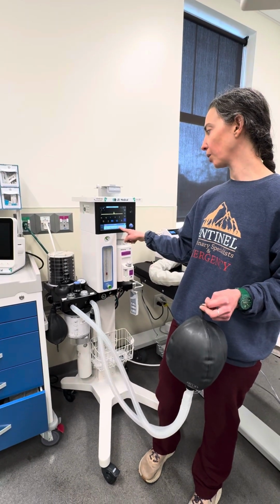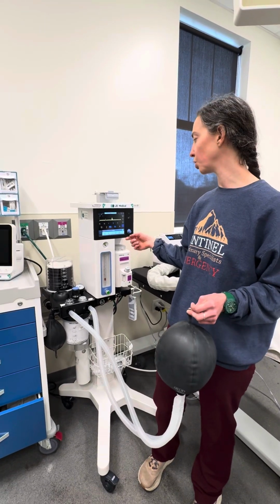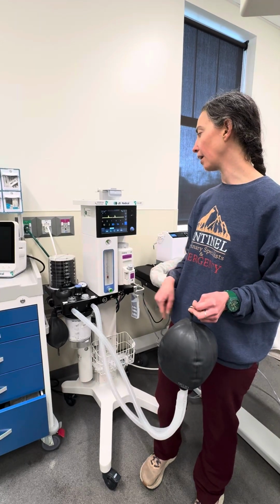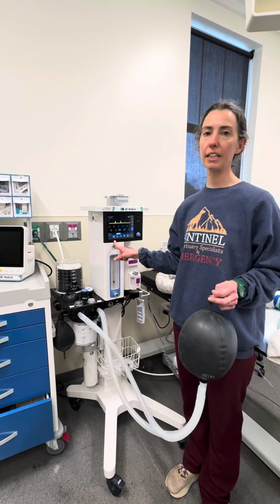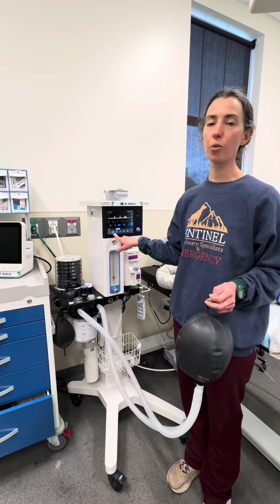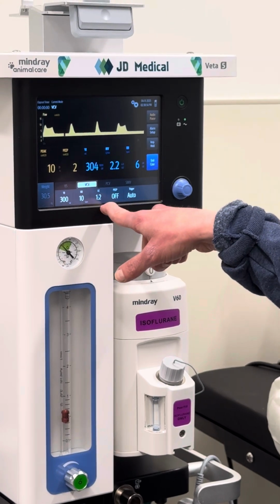You don't really have to worry about the PEEP function and the trigger function. Those are just some more advanced functions the machine can do, but most of our patients, we don't need to worry about that. So we'll go ahead and hit the green arrow because the settings we had are what we wanted. And so now you're asking the ventilator to give 300 mils and you want it to do that 10 breaths a minute with an I to E ratio of 1:2.